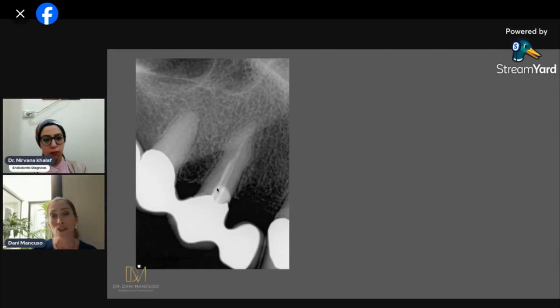So when you check this tooth, you can assume that there is a deep filling, a fiber post and a short root filling, and perhaps there is something here, or perhaps there is something there. You can't do any vitality test because the bridge is there, so there is no gingival recession. So any attempt at a sensibility test will be pretty difficult. But with experience, you can perhaps follow the lamina dura.